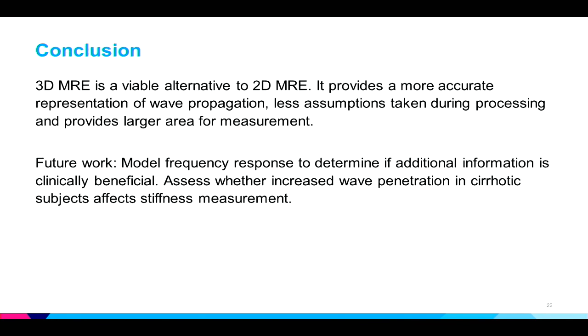So in conclusion, we think that 3D MRE is a viable alternative to 2D MRE. I think any time that you're getting a more accurate representation of what's happening inside the body, it's better for the clinicians. And in future work, to model the response to the frequency and assess whether the cirrhotic patients are going to have a problem when we use the dual drivers.